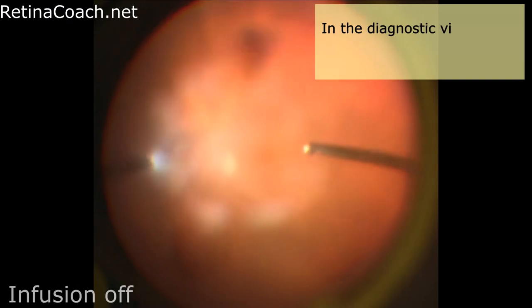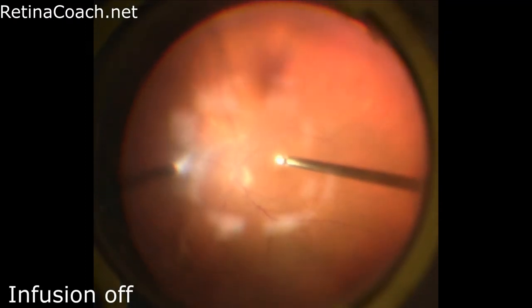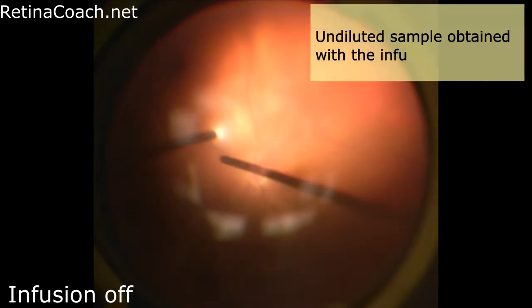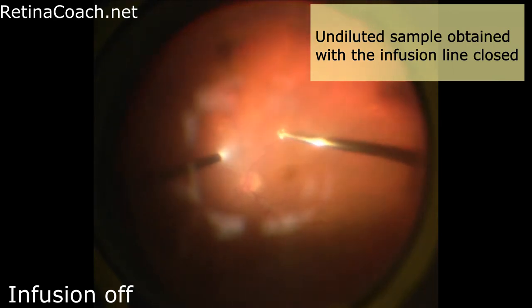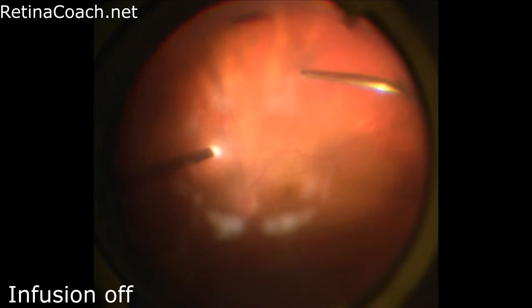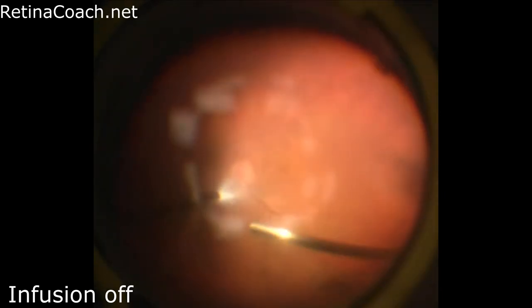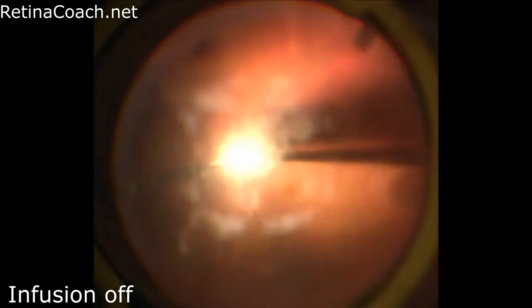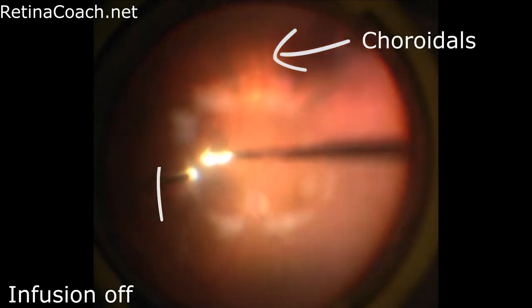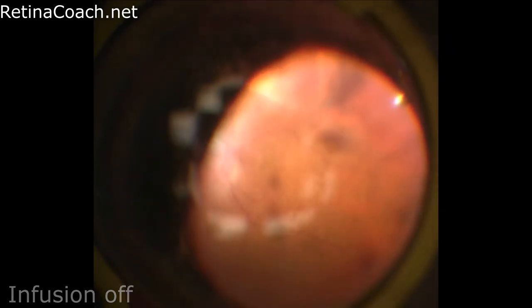Usually in diagnostic vitrectomy, both undiluted and diluted vitreous samples are taken. Undiluted samples are obtained at the beginning of the procedure with the infusion line closed. The surgeon visualizes the vitrector probe and monitors the eye for choroidals and proper removal of the vitreous. As soon as choroidals are seen, the surgeon stops vitrectomy and opens the infusion. Approximately 1 ml of vitreous fluid can be removed in this fashion.